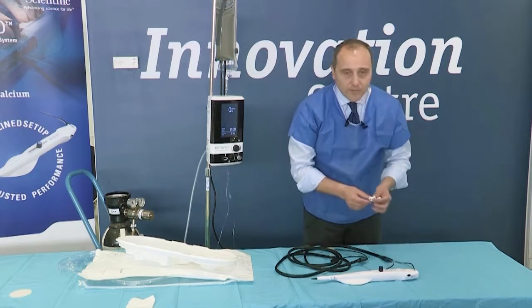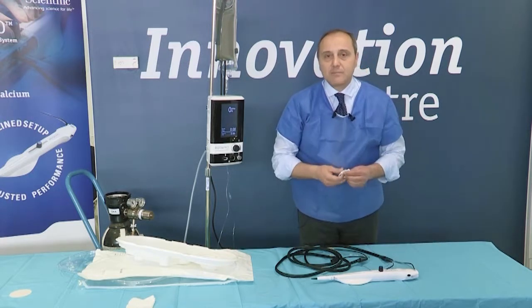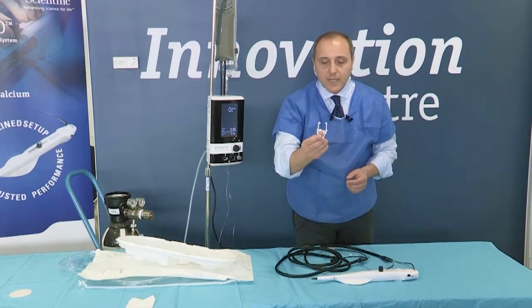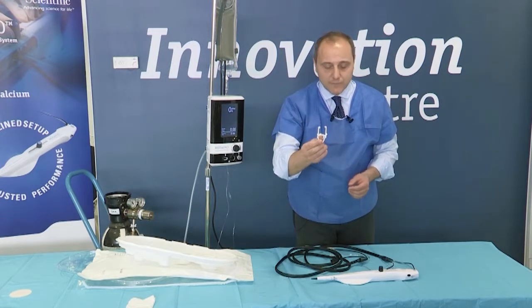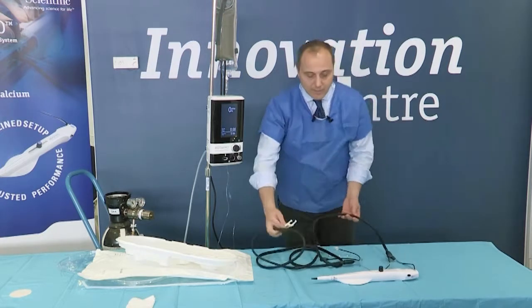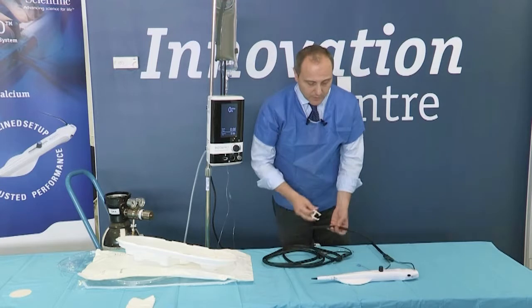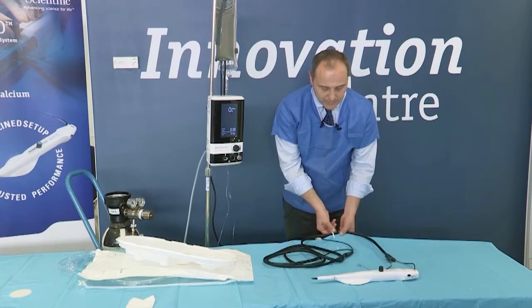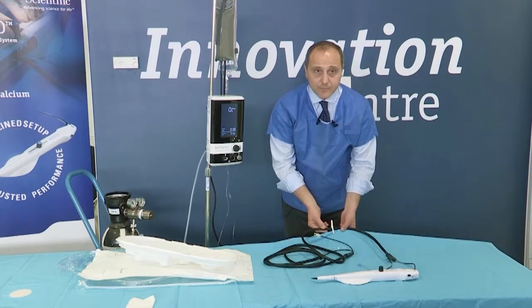Please pay notice to this clamp. It's a very important piece that will be particularly useful for the cath lab staff in order to connect this part and to stabilize this plastic tube to the towel that is present on the cath lab table, like this.